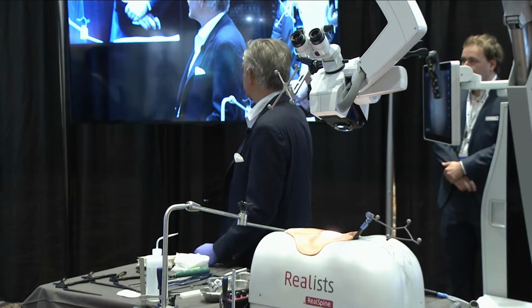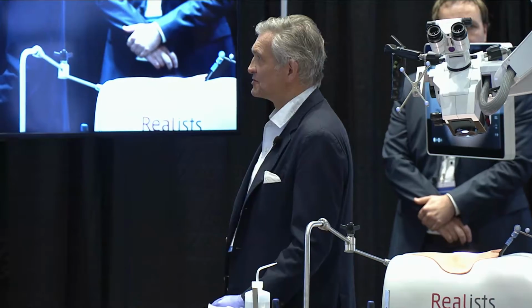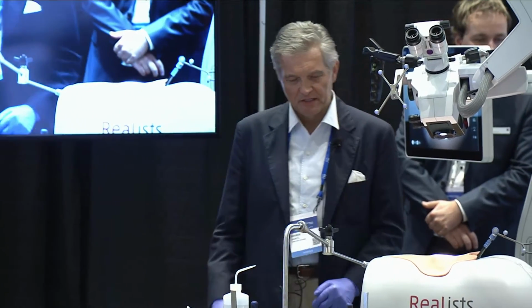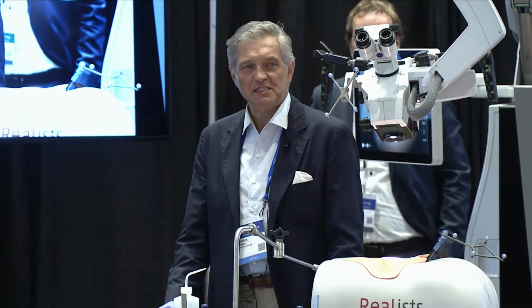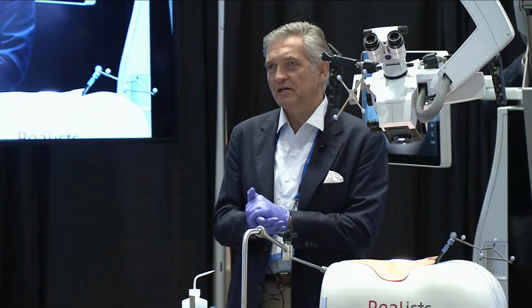So, Dr. Hartel, could you start explaining to us how you set up the OR for this procedure? Sure. So I'll walk you through a typical setup for a minimally invasive transforaminal lumbar interbody fusion. That's probably one of the most common fusion procedures that we do, and in the category of MIS surgeries, probably one of the most frequently done. There are a million different ways of doing this, of course.